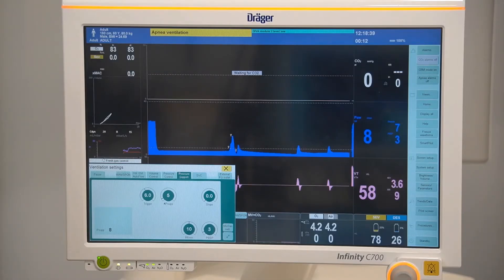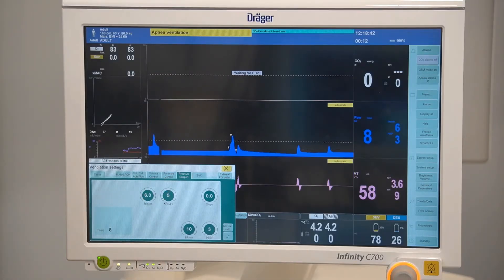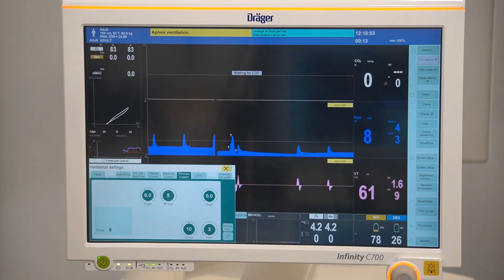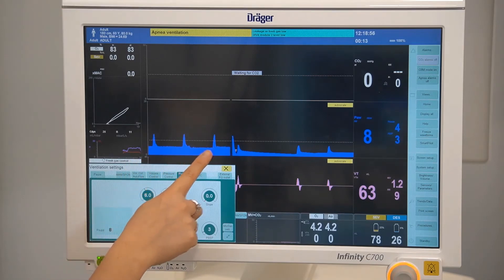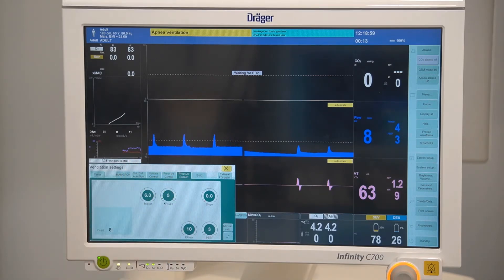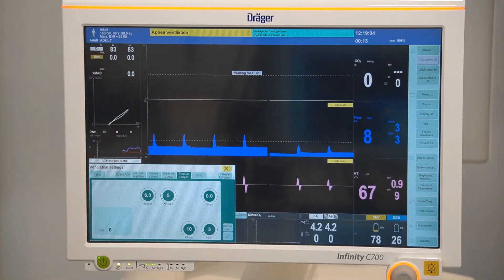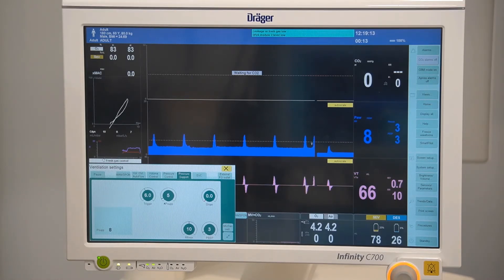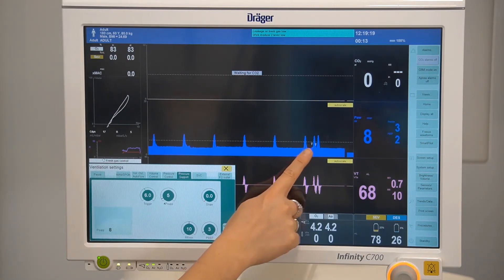In pressure support ventilation you have the ability to set a minimum frequency. If the patient does not provide inspiratory effort within that time, mechanical breaths will be delivered. After two consecutive ventilator breaths you'll see a message confirming apnea ventilation. If inspiratory effort is detected, this will be confirmed via the triangle stamps.